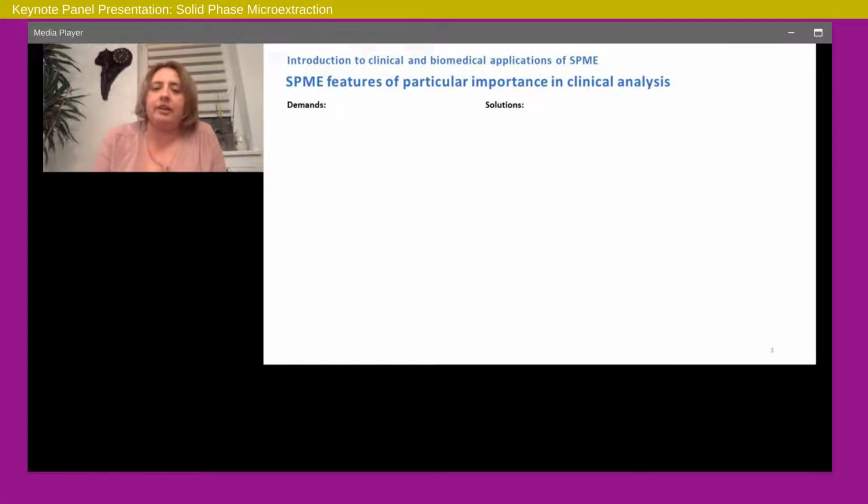Here I just want to show you the solutions SPME offers to the demands of clinical applications. First, of course, we need a very simple method of sample collection. Ideally, we don't want to collect any sample. If you want to do in vivo, as Janusz explained, it would be great.